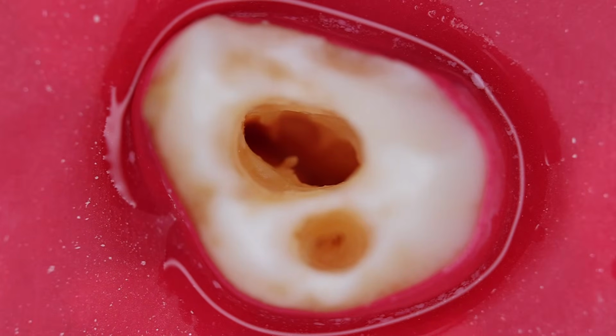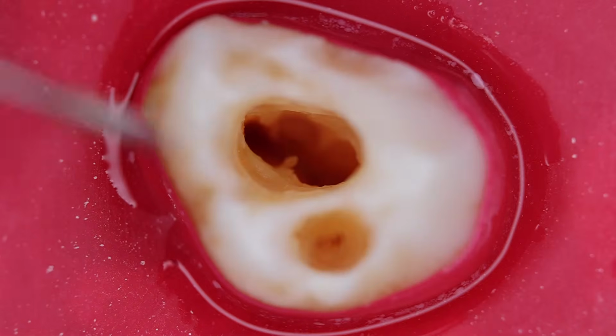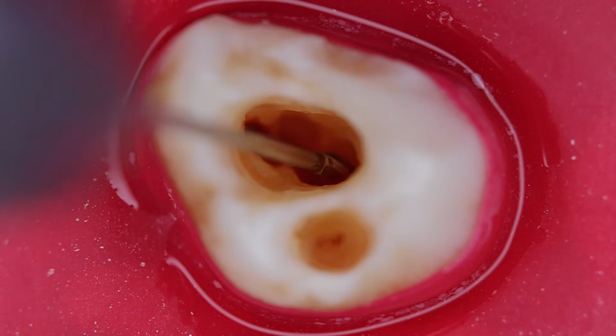Clean the fluids again, and now enlarge the large palatal canal.